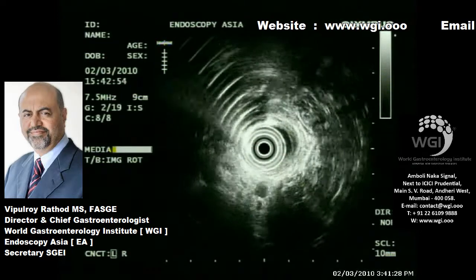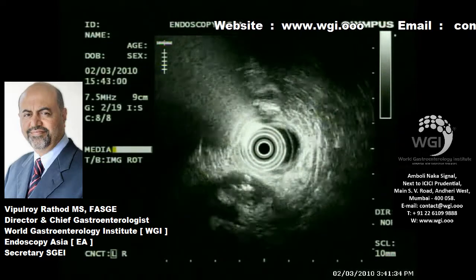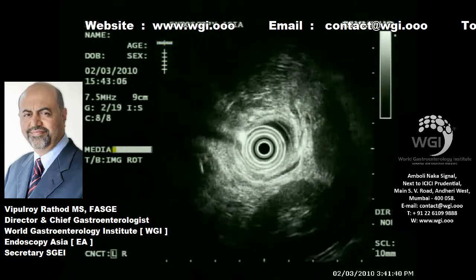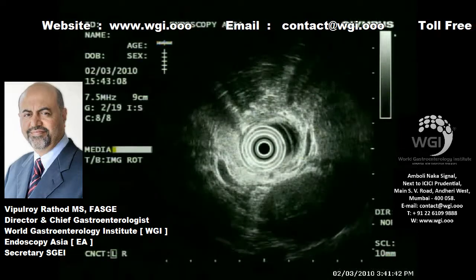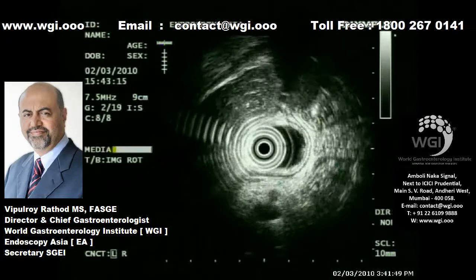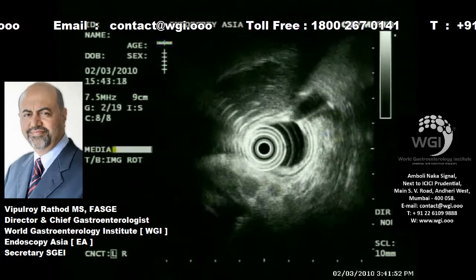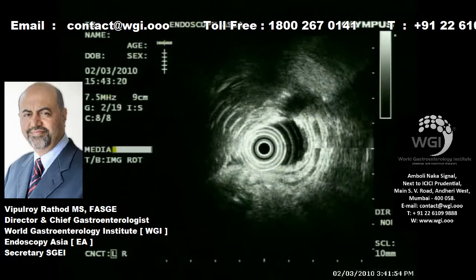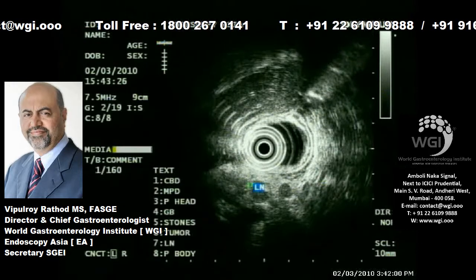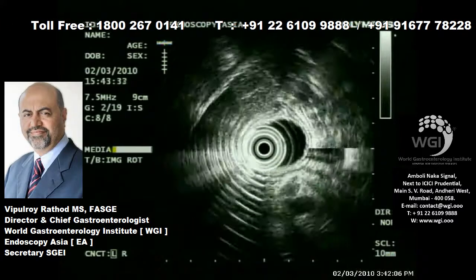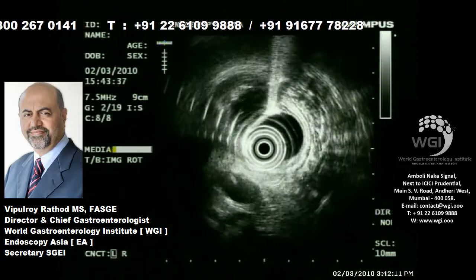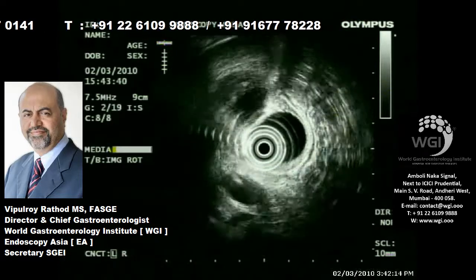You can see here a dilated pancreatic duct; my scope is now in the stomach, and we scan the entire body and the tail of the pancreas from the stomach. You can see multiple hypoechoic nodes in the celiac artery area. These are lymph nodes which are far away from the primary site, and this will have significant impact on the treatment design of these patients.